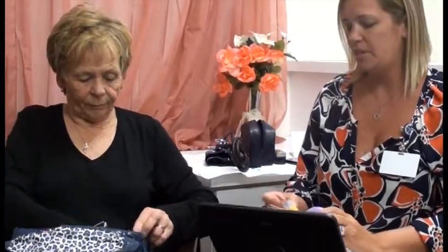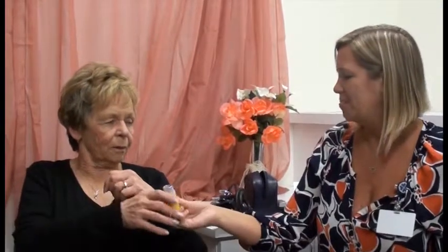Okay. And how many times a day do you take this medication? I don't take that unless I need it, which is probably right now, right? Inhale 1 puff by mouth 4 times daily as needed. Okay. So since you're a little short of breath right now, I'd love for you to show me how you go ahead and take this medication. Okay. Shake it really good. Have to take a deep breath.